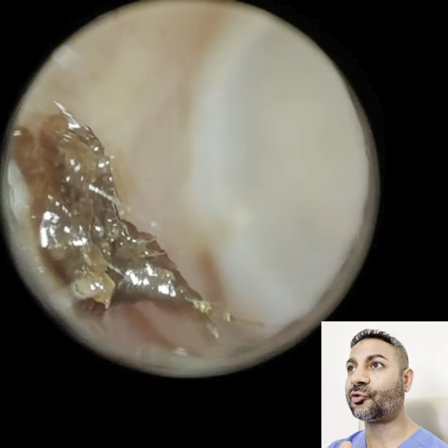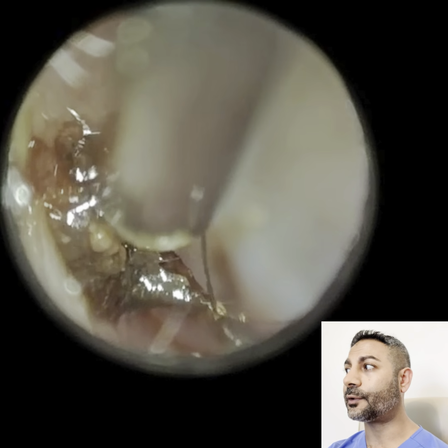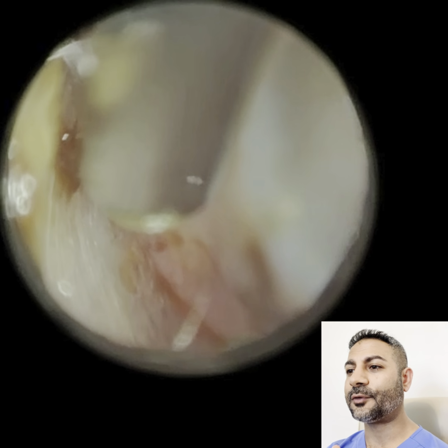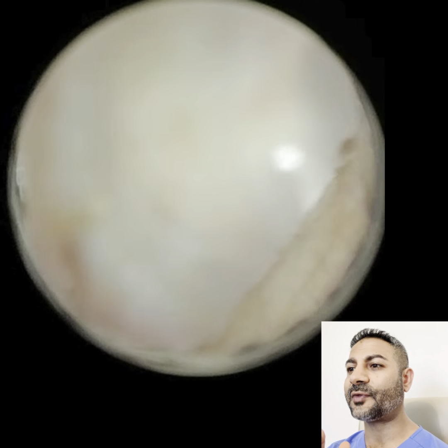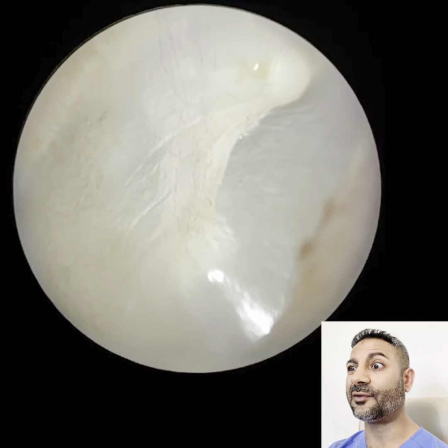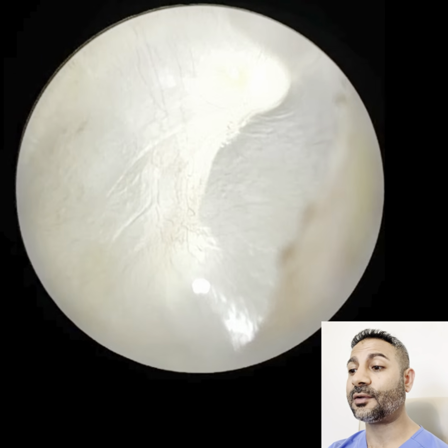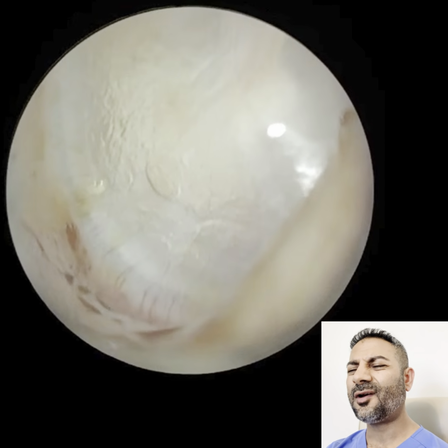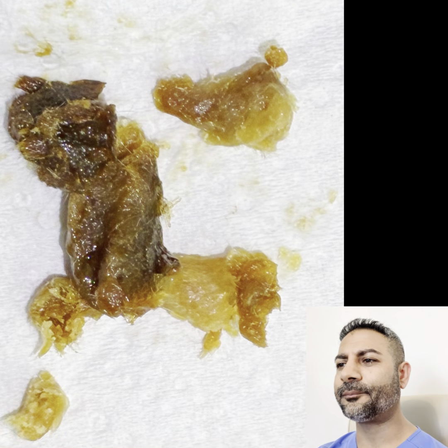Ideally that pressure should be plus or minus 50 decapascals. And that's how we know if the pressure is correct, because if more sound is being absorbed by the eardrum with the pressure being more negative, it tells us that there's negative pressure behind the eardrum. Because as I said, the eardrum is most mobile when the air pressure is equal either side. Hopefully I've explained that pretty well. I probably need to explain it in more detail. I did it off the cuff almost, and it is quite a tricky thing to explain.